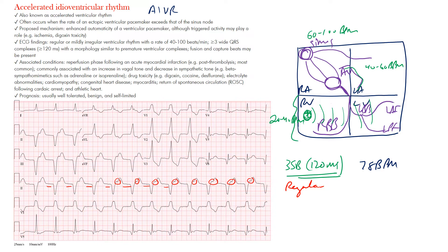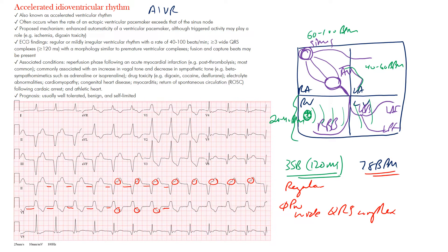There may be P waves occurring after the QRS complex — likely from retrograde conduction — but no P waves preceding the wide complexes. So we have wide QRS complexes, a regular rhythm, a rate of about 78 beats per minute, and P waves that may appear within the ST segment due to retrograde conduction back to the atria.